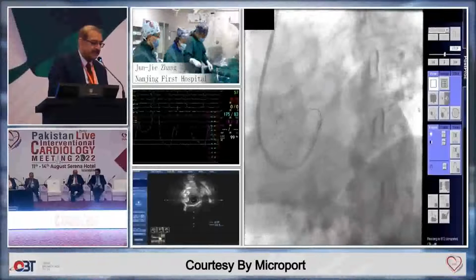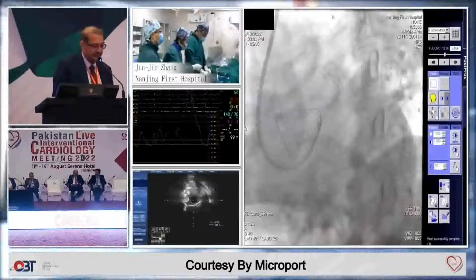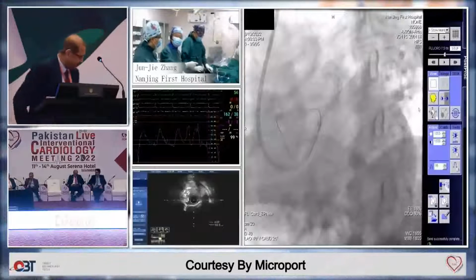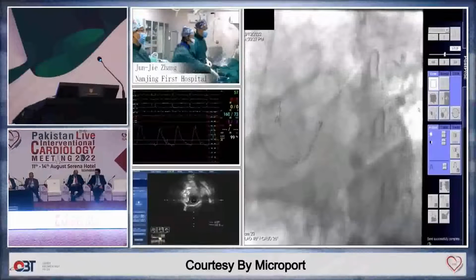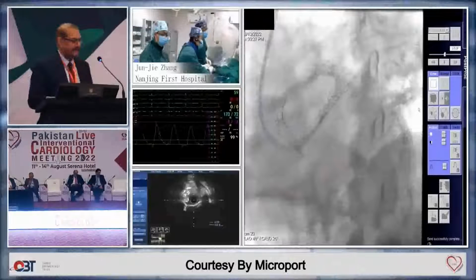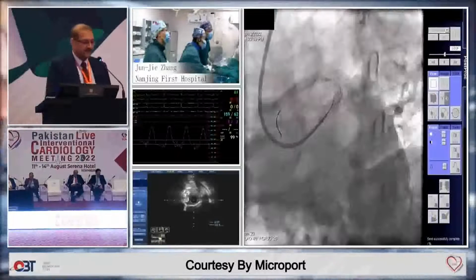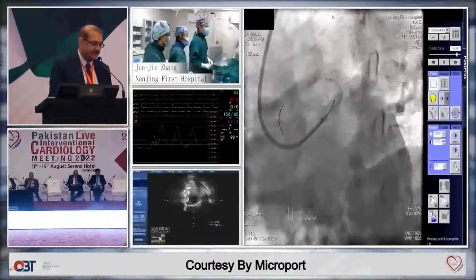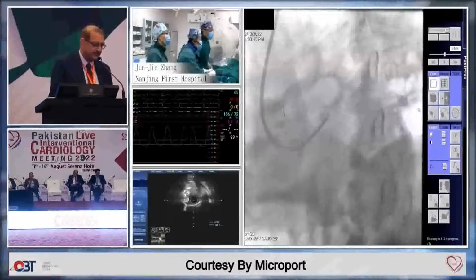Okay, so we have 7 minutes more, and then we will leave it. If it is okay, we have 7 minutes. Thank you very much. I will do the final step. I will do the final rewire, and before we rewire, we do the angiogram. Ideally you should have 10 minutes because we started late by 10 minutes, but just to be comfortable, show us the best you could.